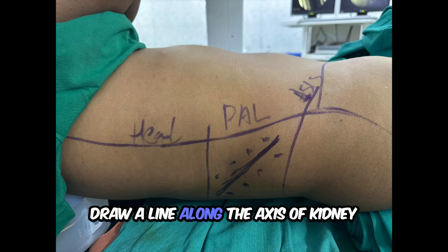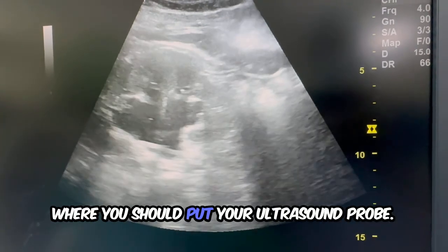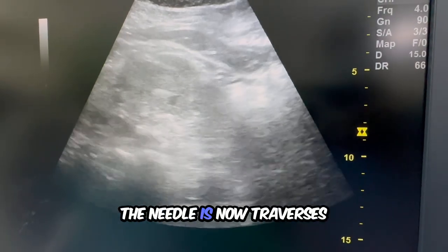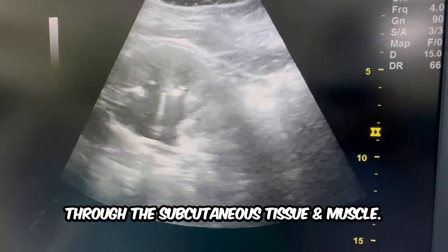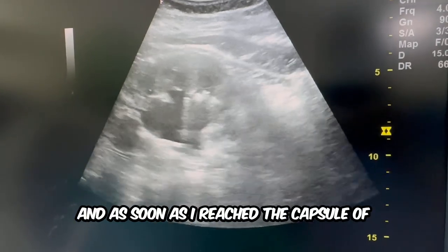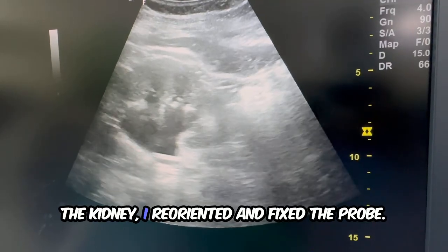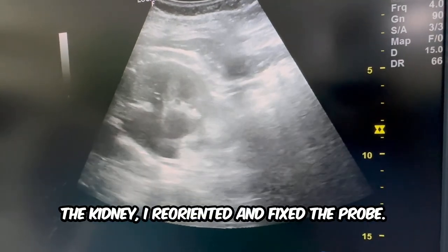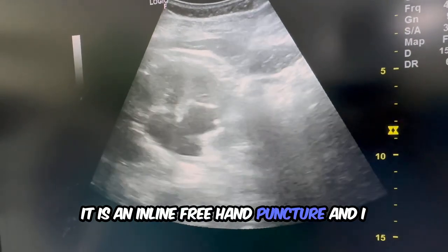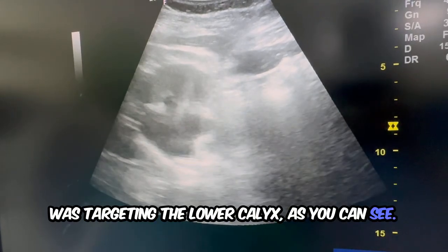Draw a line along the axis of the kidney where you should put your ultrasound probe. You can appreciate in this video the needle is now traversing through the subcutaneous tissue and muscle, and as soon as I reached the capsule of the kidney, I reoriented and fixed the probe. It is an inline freehand puncture and I was targeting the lower calyx as you can see.